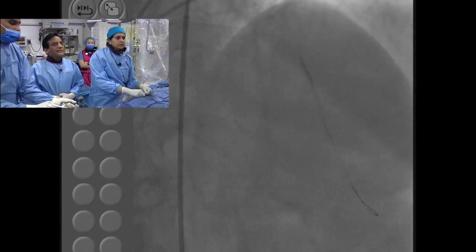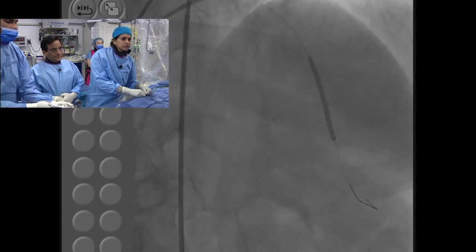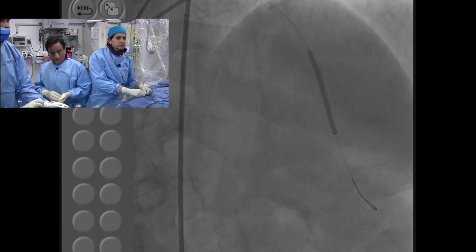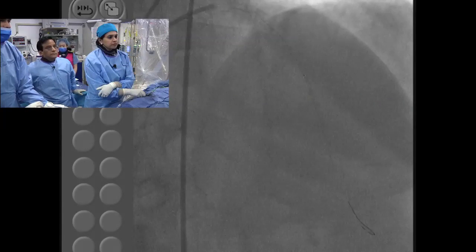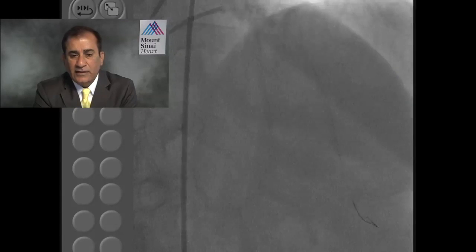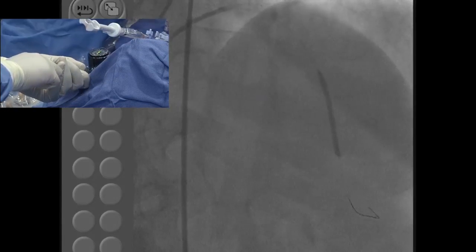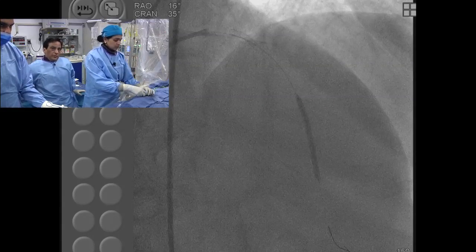Look, I have always attributed your higher success rate to larger use of atherectomy devices, particularly rotational atherectomy. It's the confidence level which I have watched here, which I think makes an enormous amount of difference. So many cases I've seen you and Anu perform, where people would shy away and not do a good lesion preparation. And I think that's a very, very important point, as you mentioned.